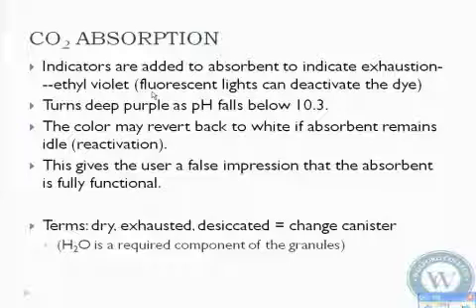The color can revert back to white at times. But if you have a completely purple CO2 canister, it's not going to turn back white. If you have one that's beginning to turn purple, a light shade of purple, you come in the next morning, it could be more white than it was when you left. That doesn't mean that it's still good to go. But you can get some slight reactivation over time as more moisture is added. The more moisture that's added, the more functional it is. But once you see that thing start turning purple, you need to get rid of it. Once it's about 2/3 of the way purple, you better shed it and get a brand new one. Okay?